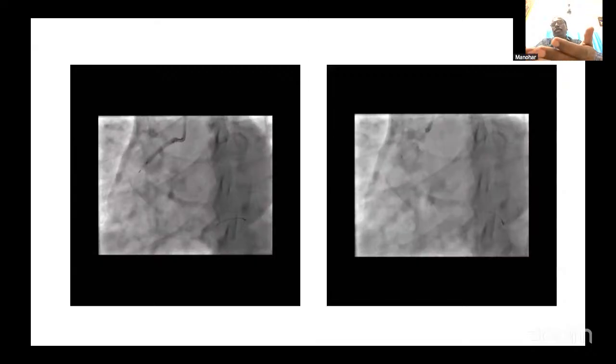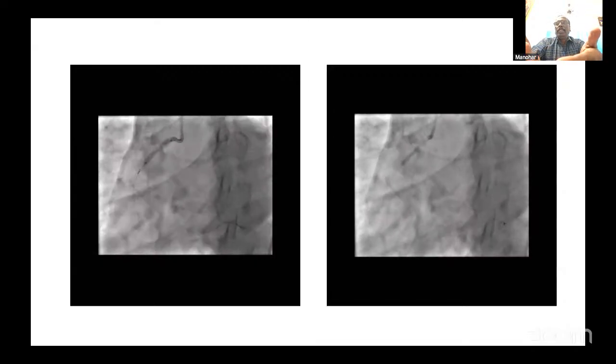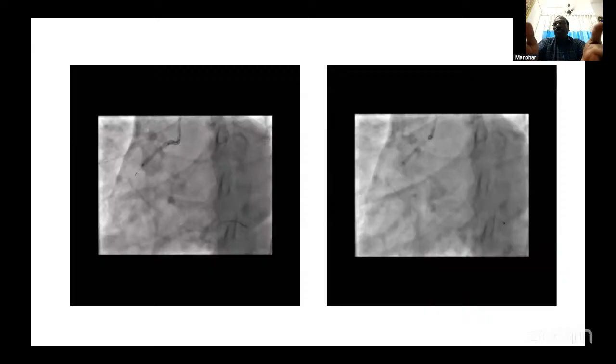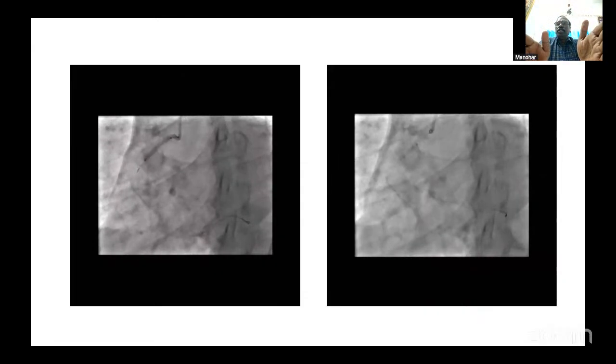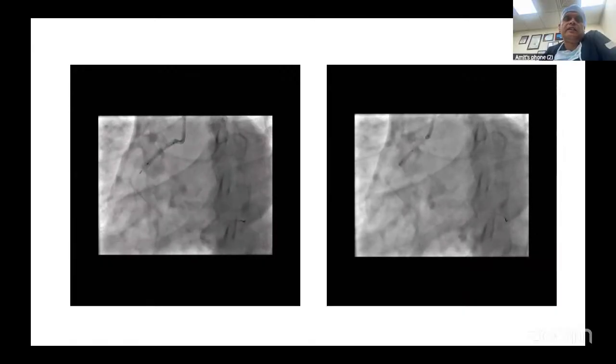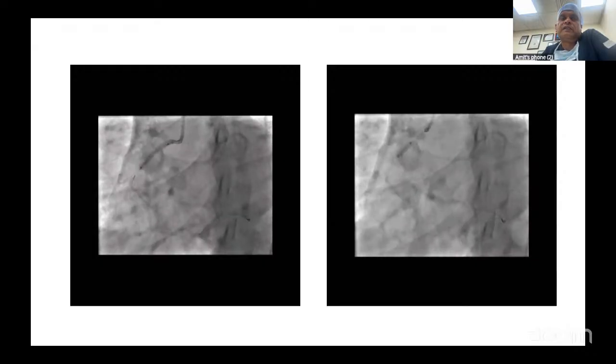That is useful because if you are using a 3 size stent, and you are using an NC balloon of 3.5 or 4, if the vessel size is 4, this will not be perfect for this stent. But Onyx will be fully expanded. That will be good apposition. That is the one problem with this stent, and the expansion is a little bit difficult here. The strut size, the side dimension of the strut, I think looks quite large enough. So side vessel closure will be lesser in this stent.